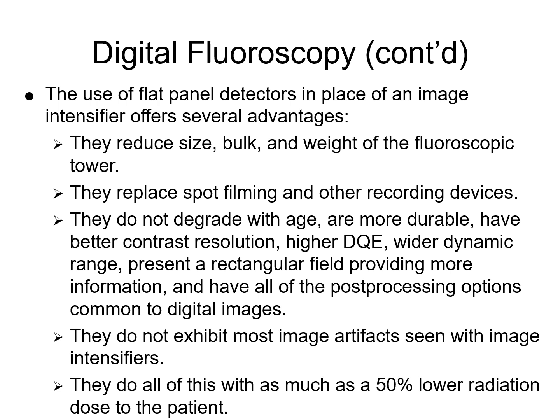Okay, with a particular live fluoro run, you display a bigger area of the tissue of the patient. Okay. The other advantage is we can tweak the brightness and contrast of a cine run, a still image.